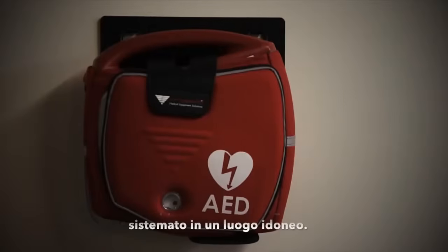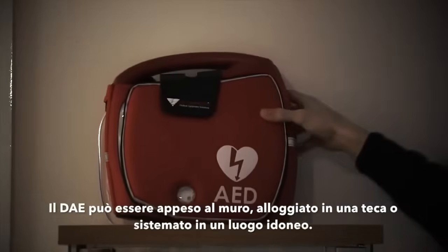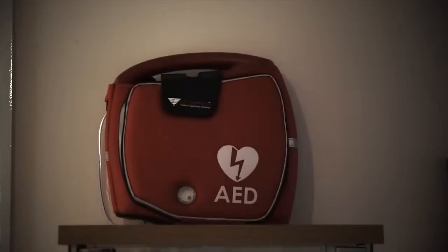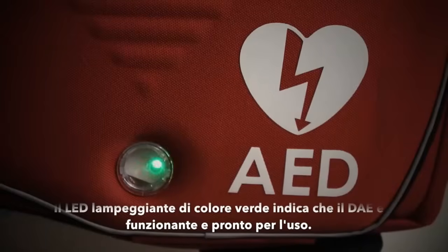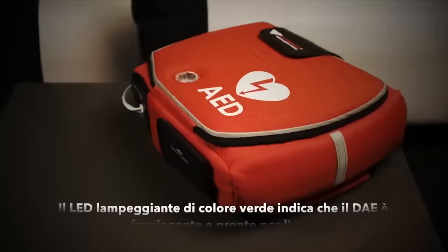The defibrillator is now set up and ready for use. It can be mounted on the wall, kept in a purpose built cabinet or stored in a convenient location in its bag. A green status light flashing on the front of the machine indicates that the Rescue Sam is in standby mode and ready to be used.